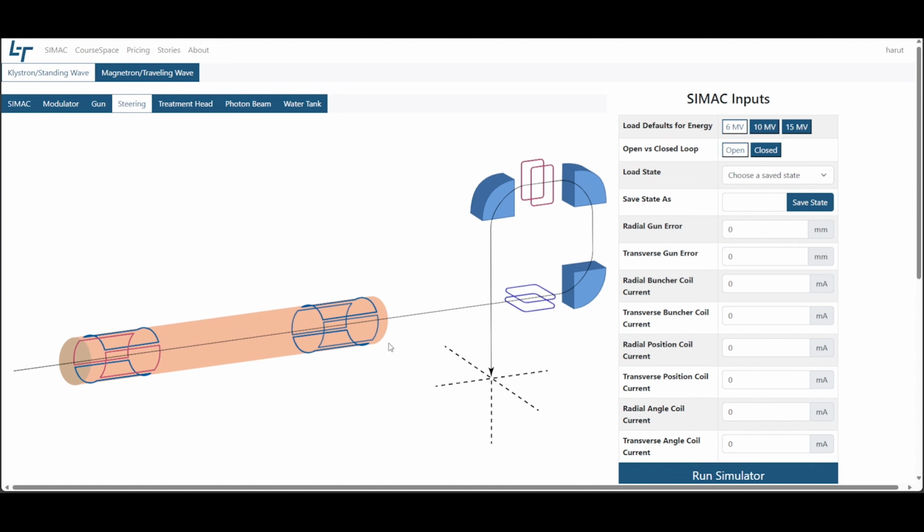These steering magnets, located along the beam path, generate magnetic fields that interact with the moving electrons. According to the Lorentz force law, when a charged particle like an electron moves through a magnetic field, it experiences a force perpendicular to both its velocity and the magnetic field. As the electron beam passes through the magnetic field, it is deflected. By adjusting the strength and orientation of these magnetic fields, we can precisely steer the beam.